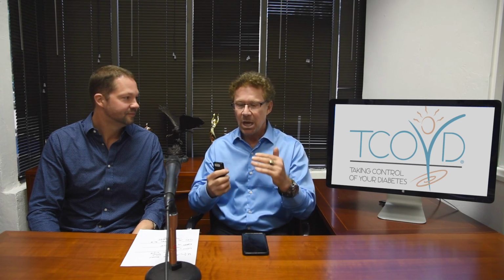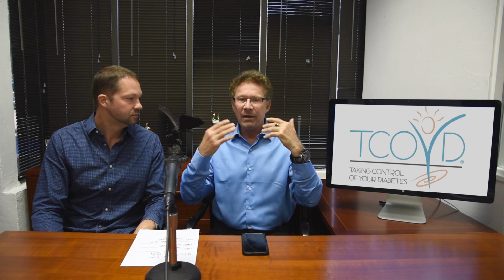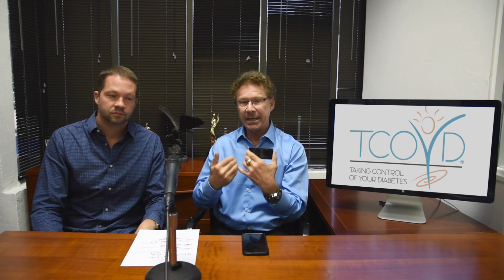Let's talk about lows. I set my low at 80 because if I set it any higher, you're going to get a lot of alerts. But this is me, not anybody else. And don't forget the lag time. If your blood sugar is dropping rapidly, even though your CGM may go off at 79, it may be 20 points lower depending how fast you're dropping.